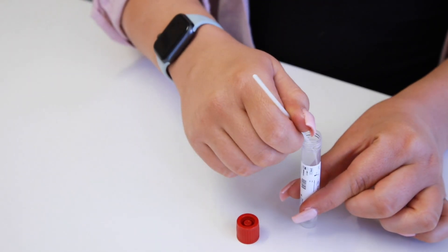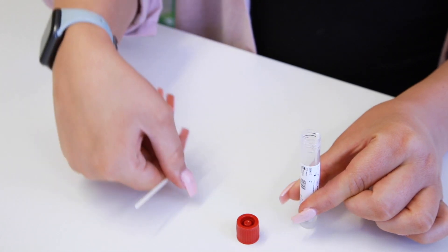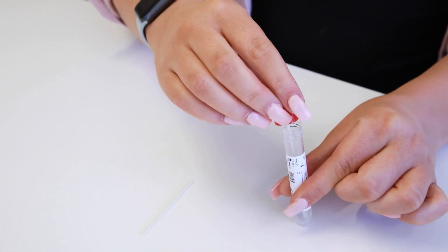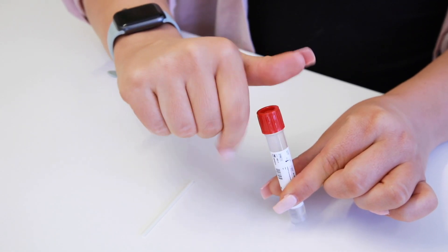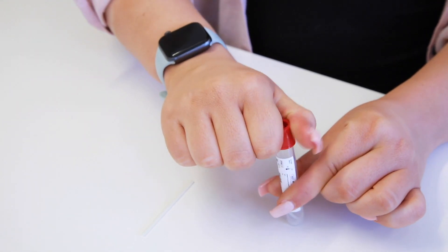Place the fabric end of the swab into the tube containing the liquid and snap it in half at the breaking point line, leaving the collected sample in the tube. Firmly replace the cap on the collection tube, being careful not to spill the liquid.